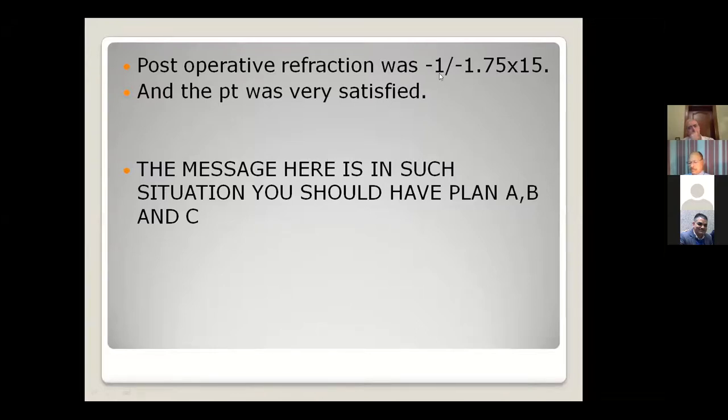The post-operative result of this patient was very satisfactory. Refraction was minus 1 with minus 1.75 cylinder at axis 15. And the patient was satisfied.